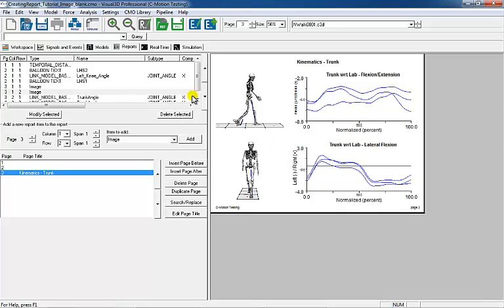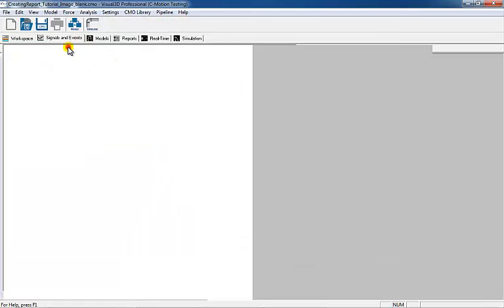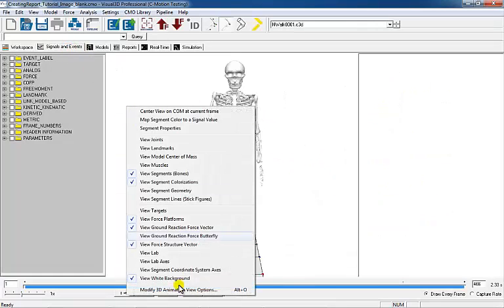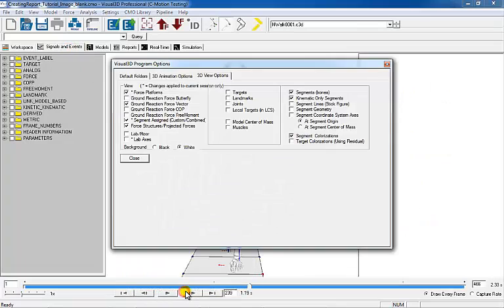Make sure to return the 3D animation view options back to the original settings.